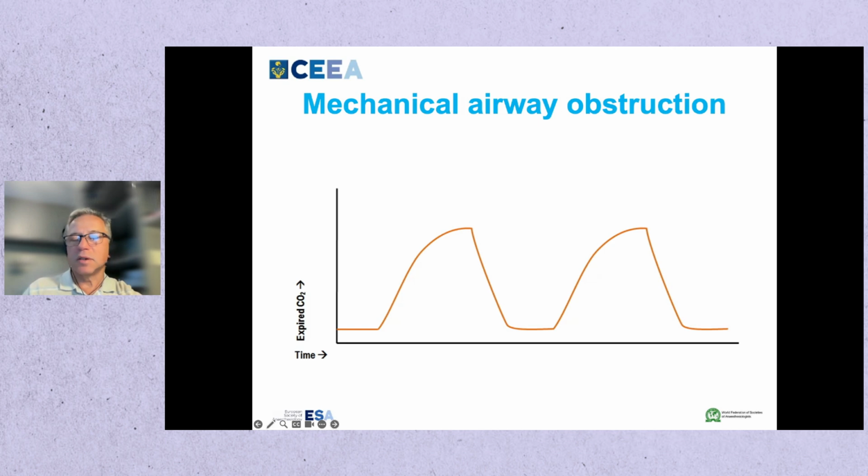This is the representative trace of a mechanical airway obstruction. In the case of airway obstruction by some sort of fixed mechanical obstacle, for example, a big gross tumor, the inspiratory flow will also be affected. Thus, both the transitional phase and the inspiratory phase will be affected. And most strikingly, the inspiratory phase slope will become less steep, indicating that the obstruction cannot be overcome even by a powerful ventilator turbine. This pattern can be generated without any pathology by the intensivist who sets the inspiratory time to be prolonged for whatever reason.